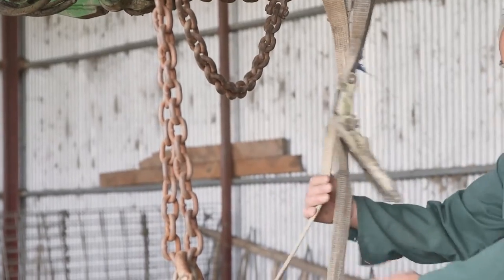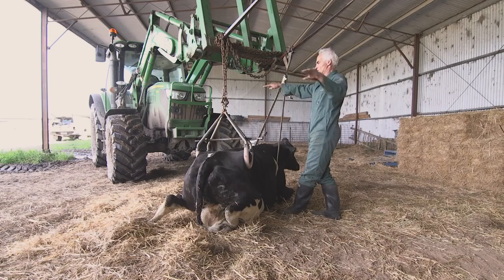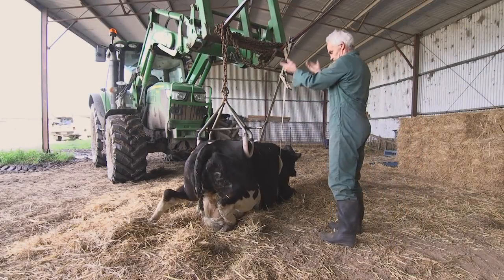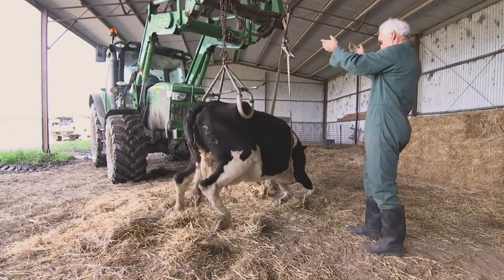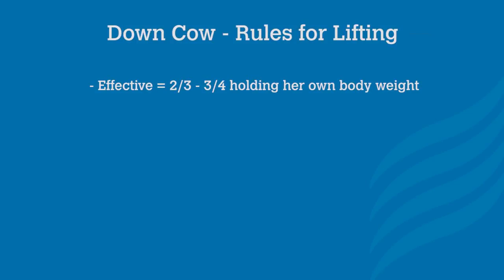The secret is to make sure the chest strap is the correct length so when she's lifted her back is kept horizontal. If the cow is standing effectively — meaning she's taking about two thirds to three quarters of her own weight — continue the lift.